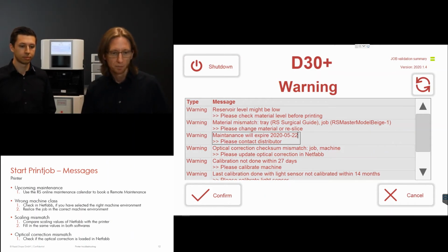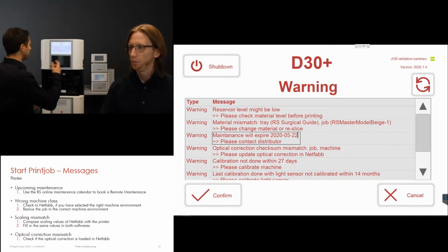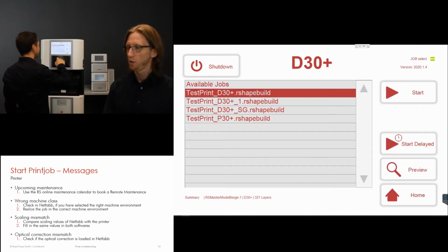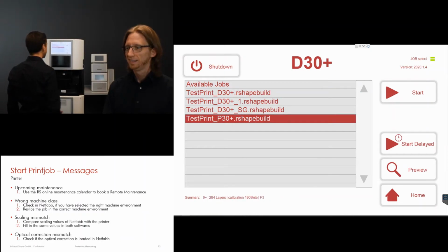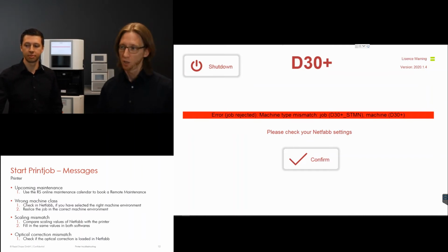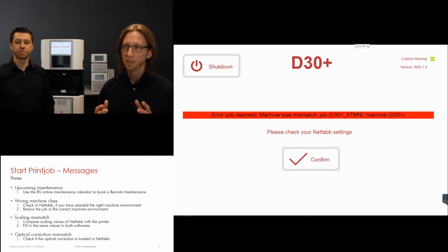All right, so let me just quickly move on with the next one. That would be a wrong machine class. Robin, maybe you can highlight this for us. I think this was in a different job. Exactly, because otherwise we couldn't show. Yes, that's really nice. Maybe you can see this right here. It appears even before you get the warning messages. So the job is rejected because it is a wrong machine class. As you can see, we are currently working on a D30+, which is always visible on top of the machine, so that we know all the time which machine class we have.